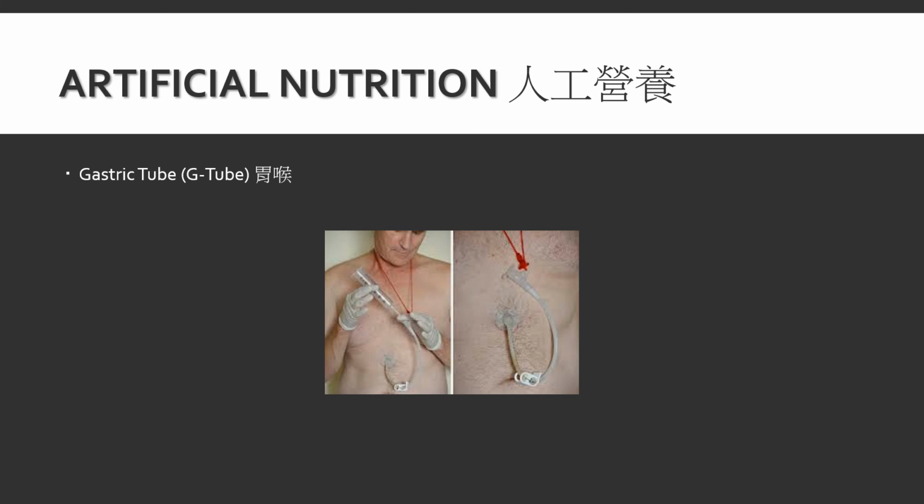Having a tube going into the stomach is not very uncomfortable for the patient. In fact, the tube can stay there for a very long time. The patient can recover and be able to eat again, and we can just leave the tube there. We can just flush it daily to make sure that it is open and to clean it to prevent infection.